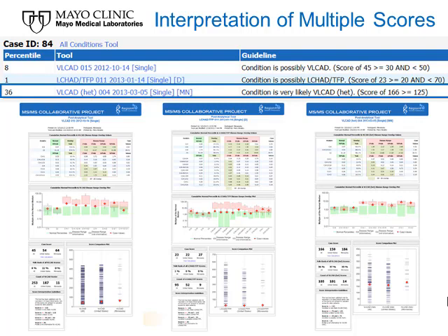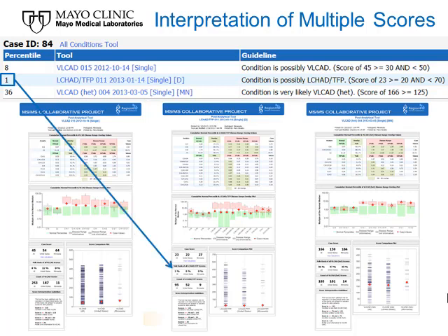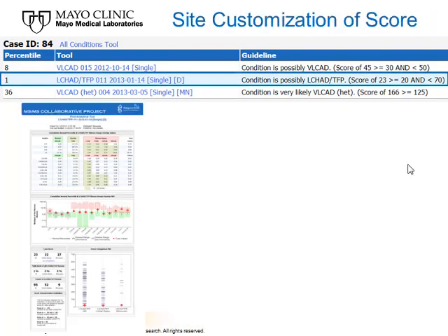Instead, it should be framed like a differential diagnosis between VLCAD deficiency and VLCAD carrier, and a verification that the score for LCHAD deficiency, barely above the first percentile, is indeed sufficiently significant to warrant a referral to follow-up. As discussed extensively in the previous segments of this series, the degree of overlap between reference and disease ranges is the conceptual foundation of a post-analytical tool.